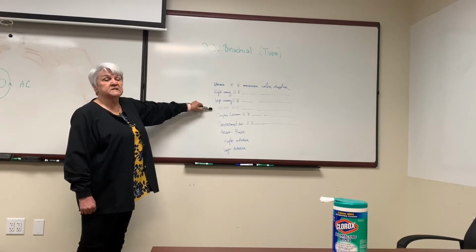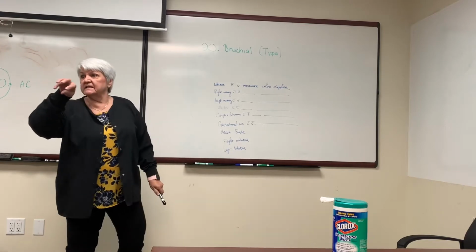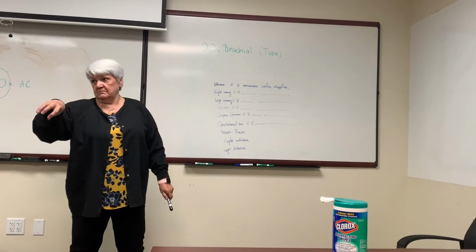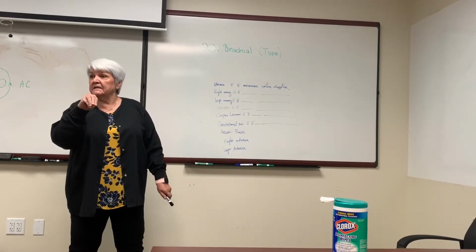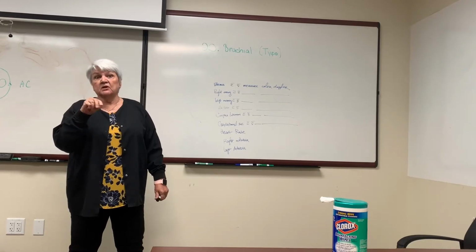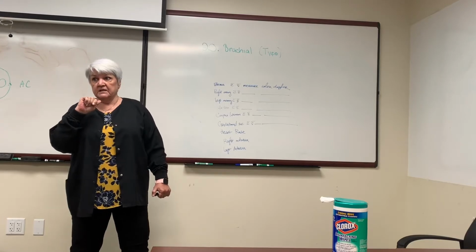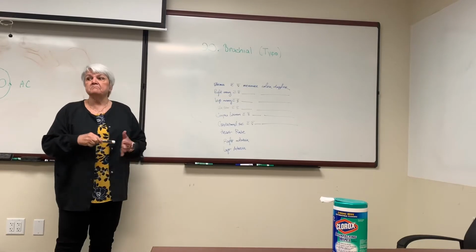Okay? Now, it's not going to be midline, because as soon as it lands and attaches itself, it's going to start burrowing down. If you see a gestational sac midline, you have an ectopic pregnancy. That's called a pseudo-gestational sac. Okay, a pseudo-gestational sac, if it is midline.